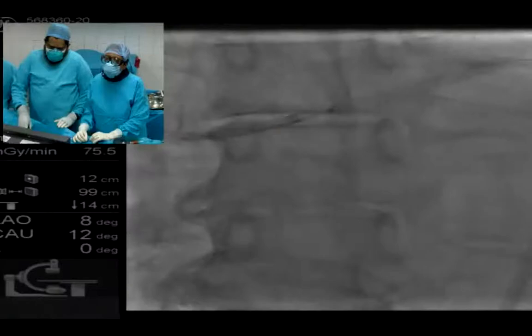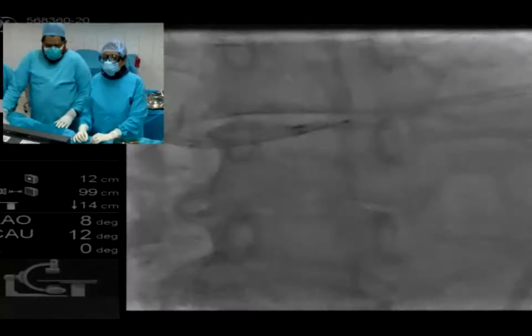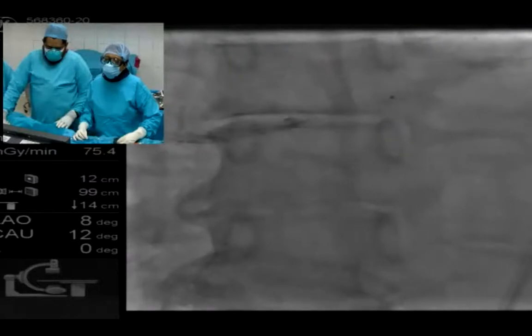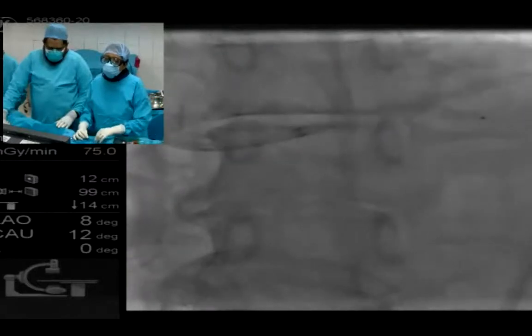So we've rewired our LCX for the second time. Was it possible to ensure that it was crossing through the proximal struts? It was possible to do that in this situation. In a real world situation, we want it to cross through the proximal strut. OCT is the one. That was the plan, to show with OCT. Yes. So the micro is not going that easily. Maybe we can rewire again. So it went. Looks good, right? Yes. So we're removing the micro catheter again.